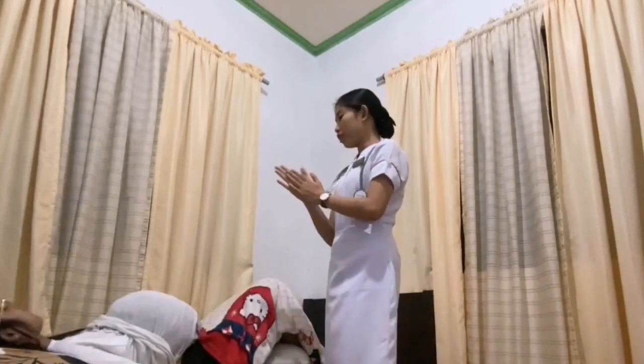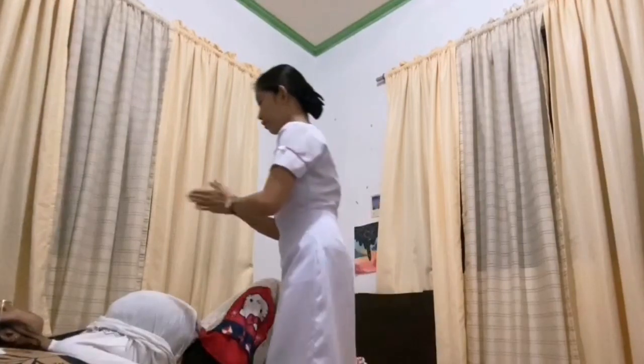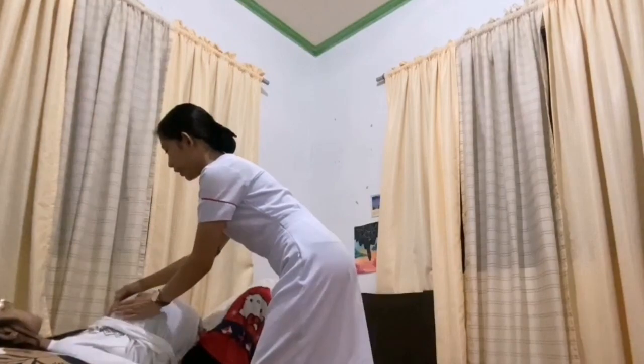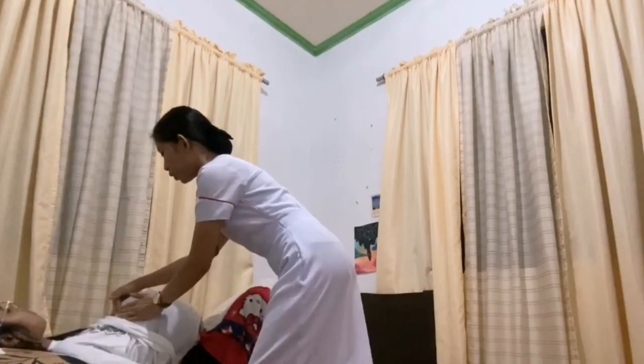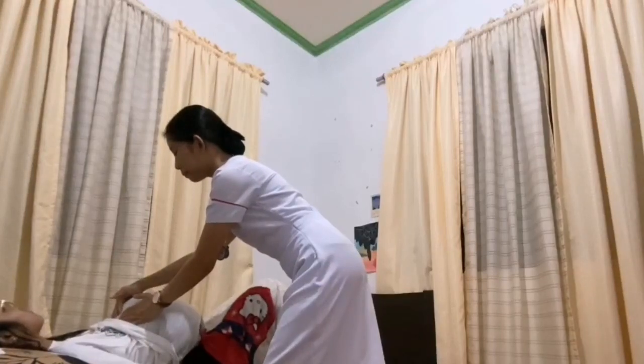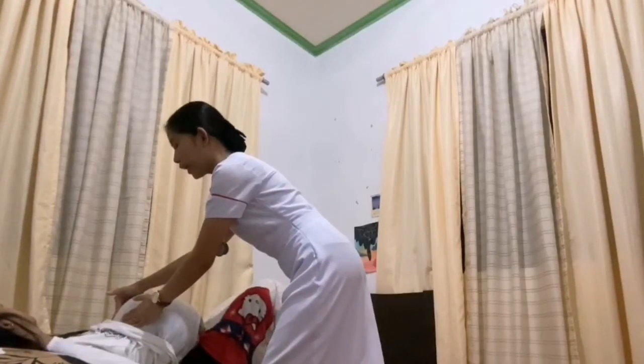So ma'am, I'm going to palpate your abdomen. So I assume that this is the buttocks of the baby.